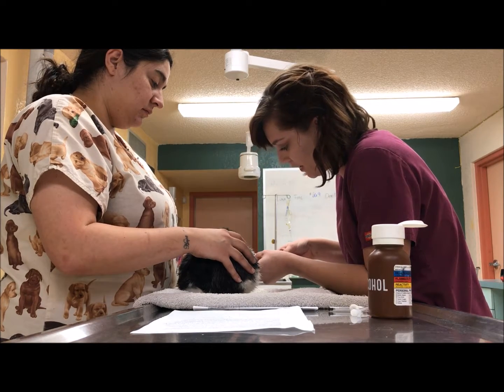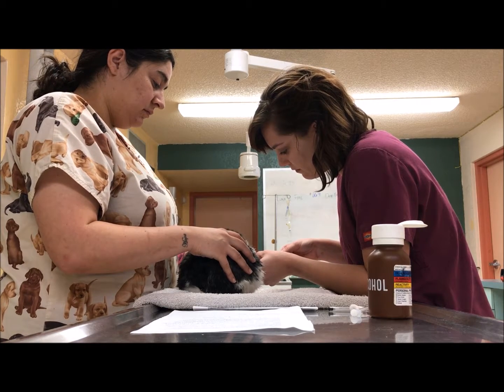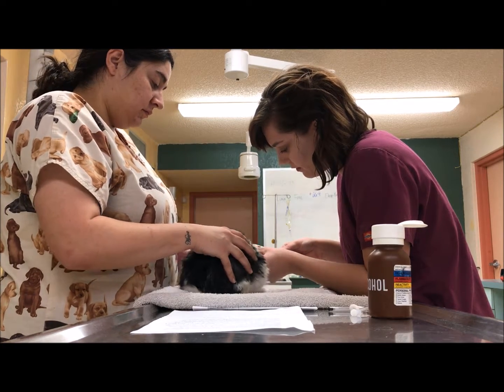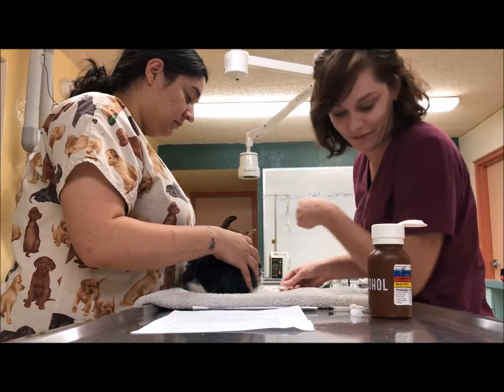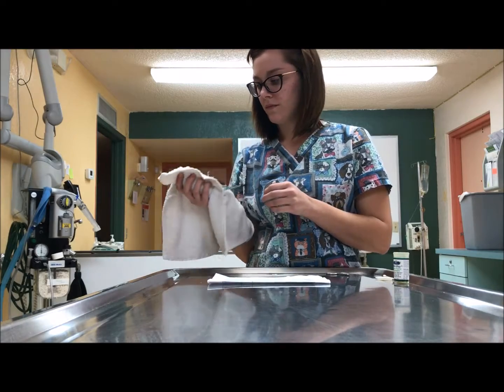into the vein, pull back on your plunger, until you collect your sample, and that's it. All right, you're good to go.